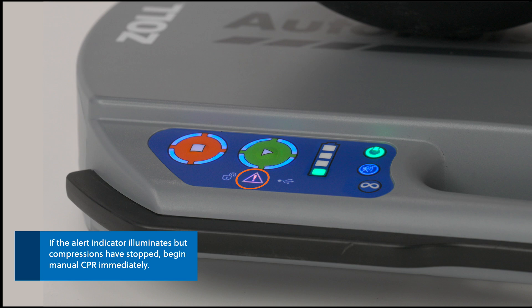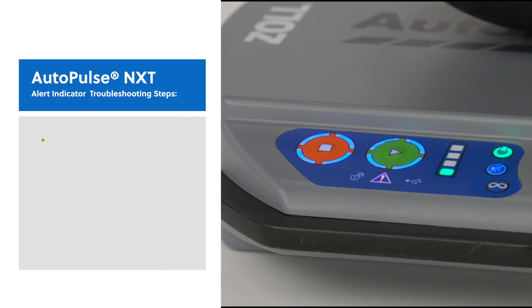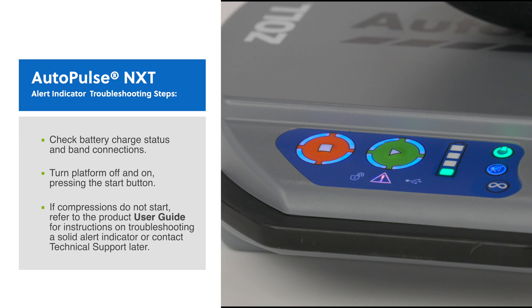If the alert indicator illuminates but compressions have stopped, begin manual CPR immediately. Check battery charge status and band connections. Turn the platform off and on, pressing the start button. If compressions do not start, refer to the user guide for instructions on troubleshooting a solid alert indicator or contact technical support later.